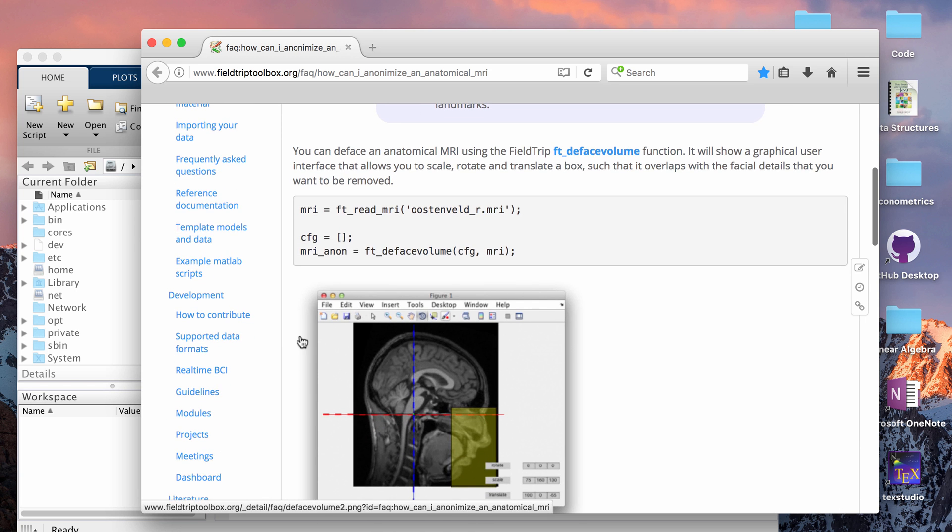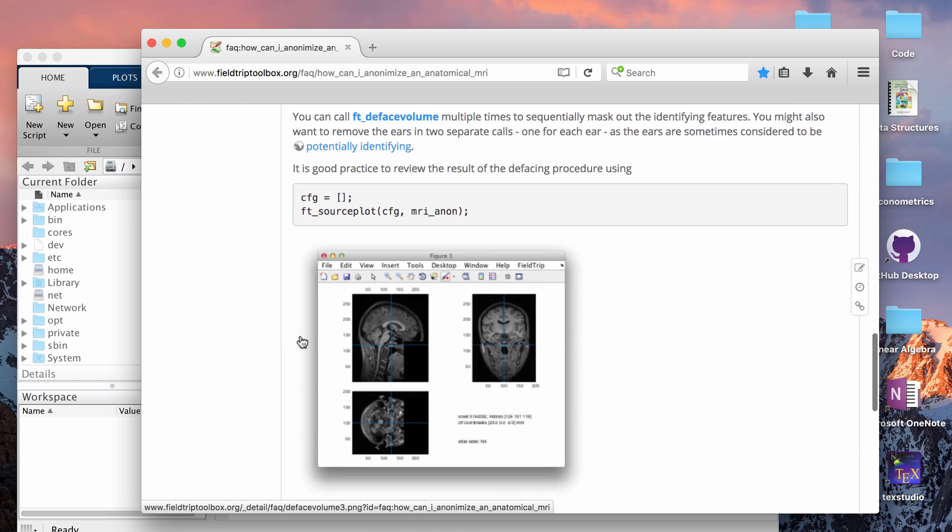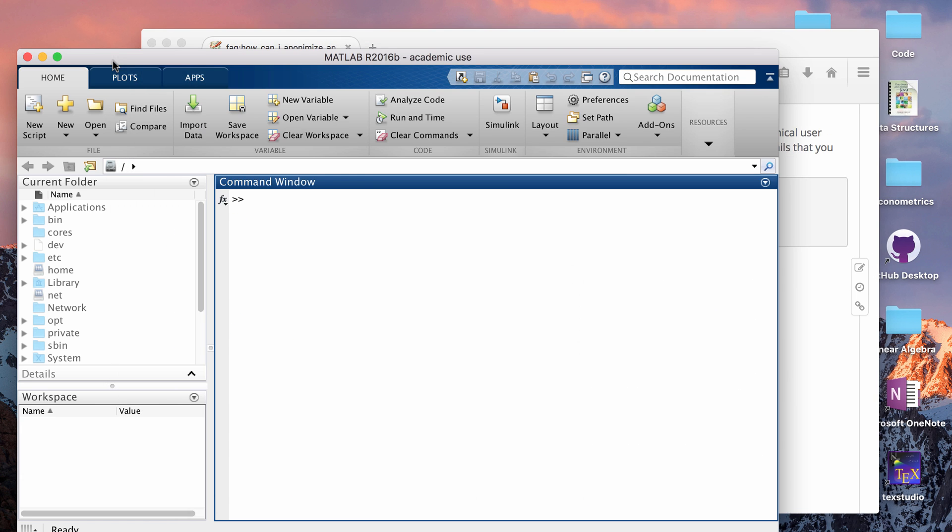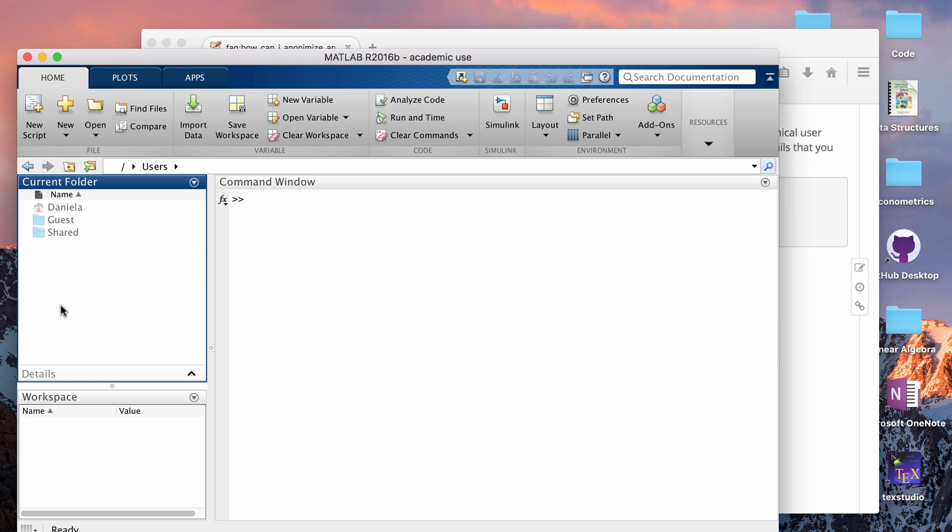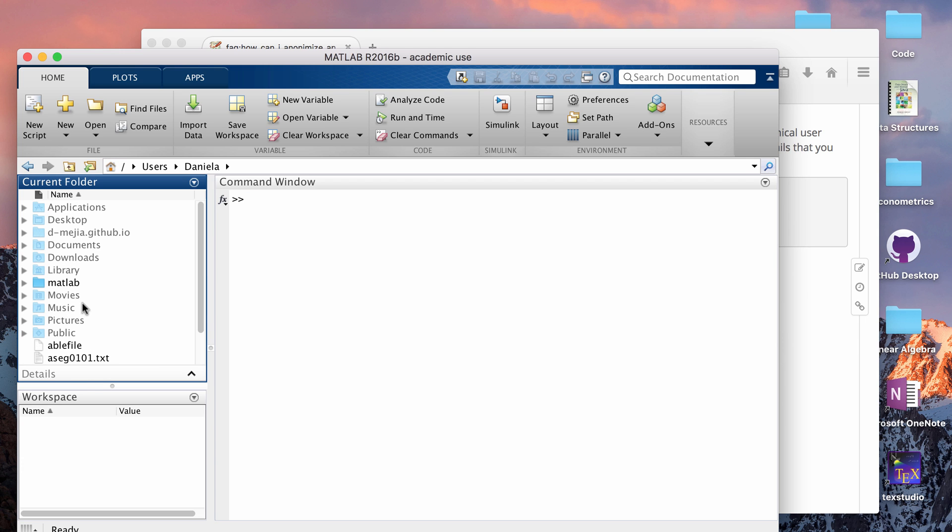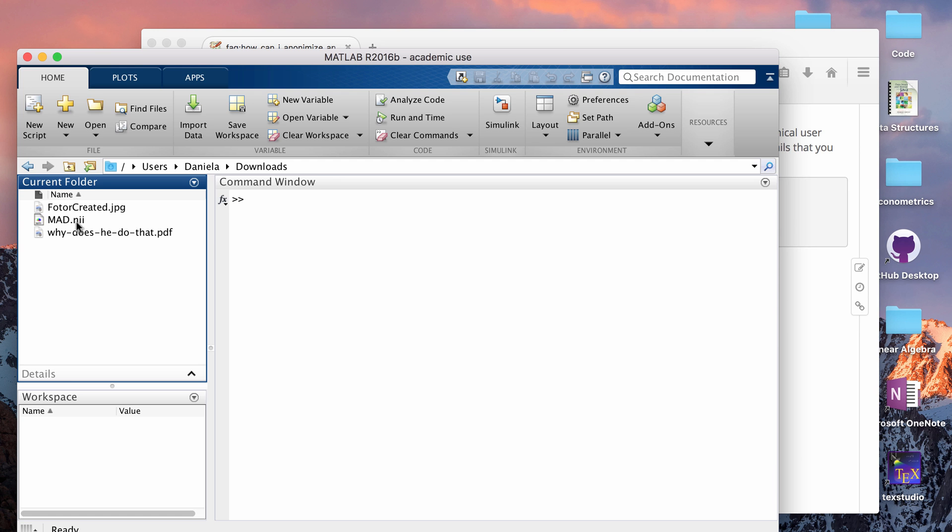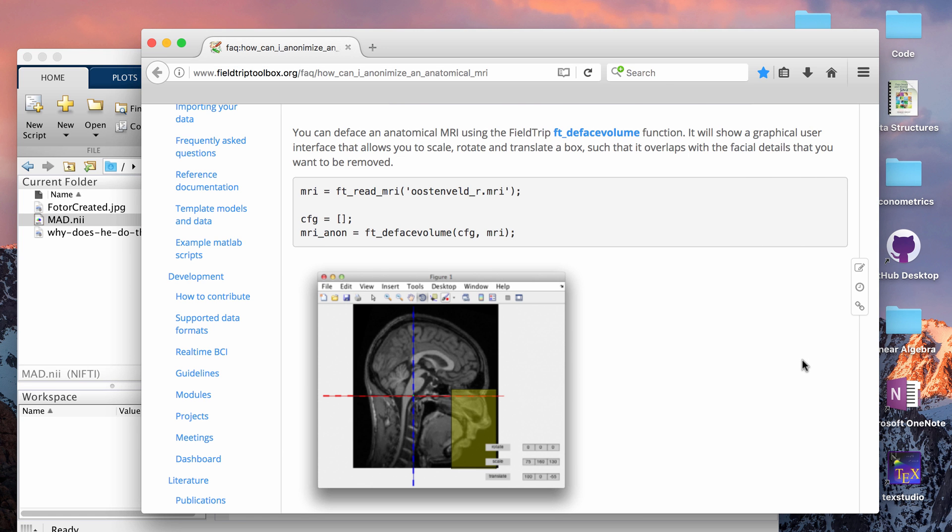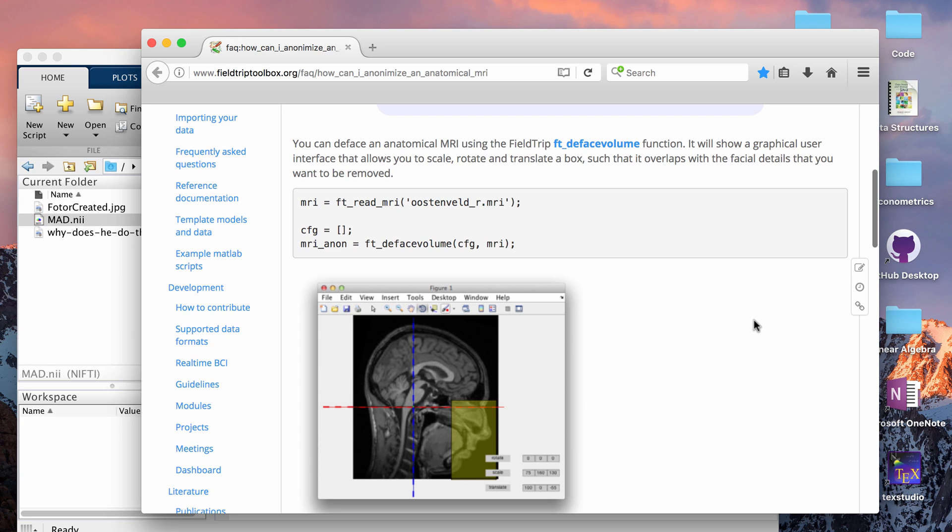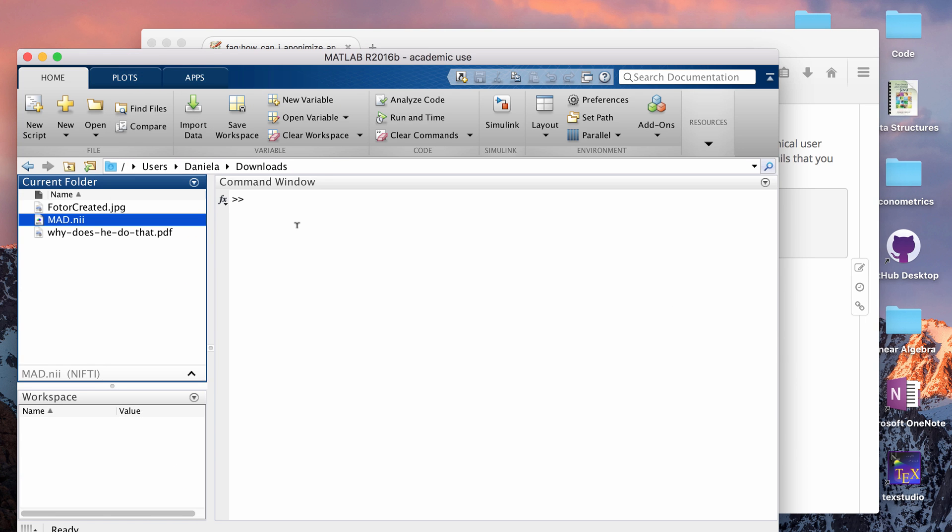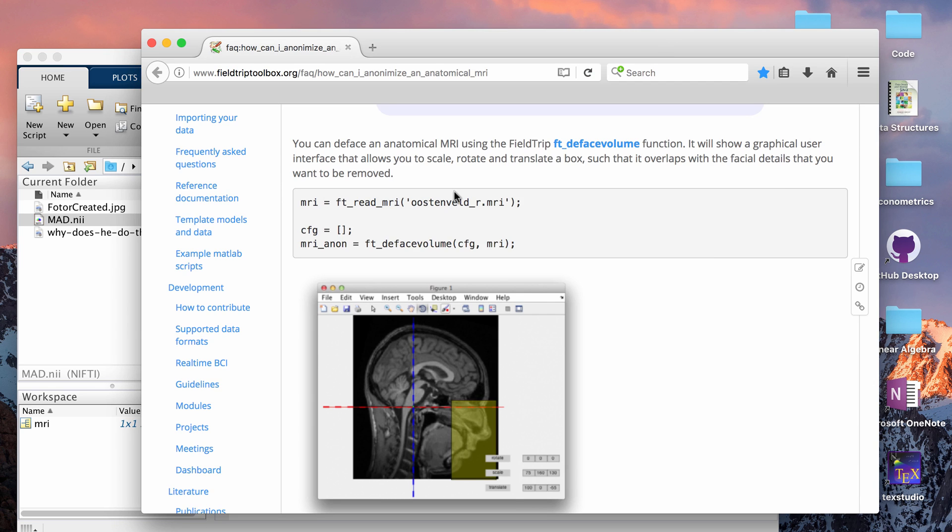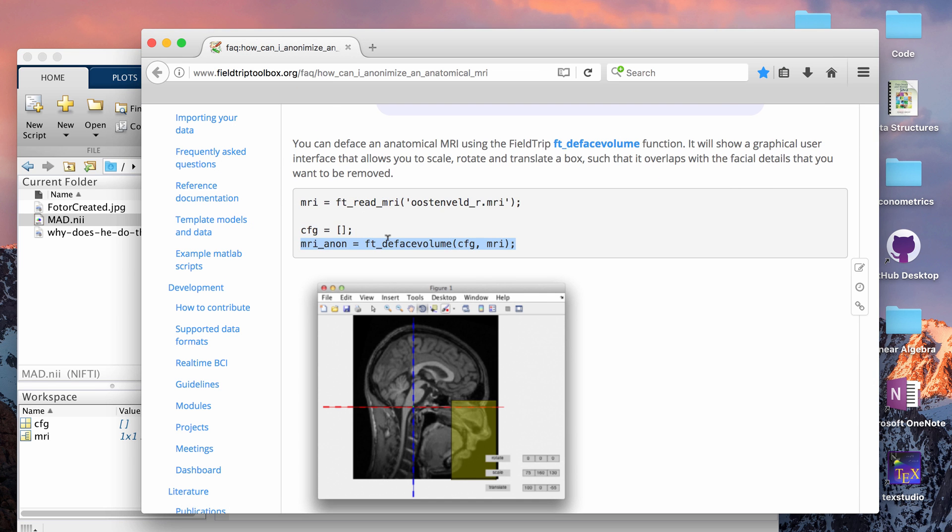So it's a really simple process to deface. You want to get whatever MRI scan you have. For me it's going to be in users and then I have it in my download folder. So it's going to be this nifty and it doesn't have to be a nifty. It can be, I think it'll recognize most file extensions. But for me I'm just going to use nifty and it has a couple lines of code here that you can use. So the first code is to put in what the MRI data is called. So you do that and then you create this empty array and then you put in this line of code.